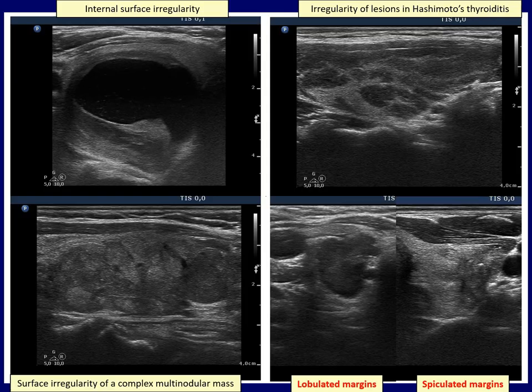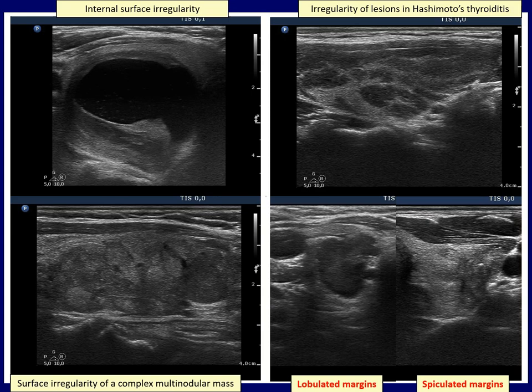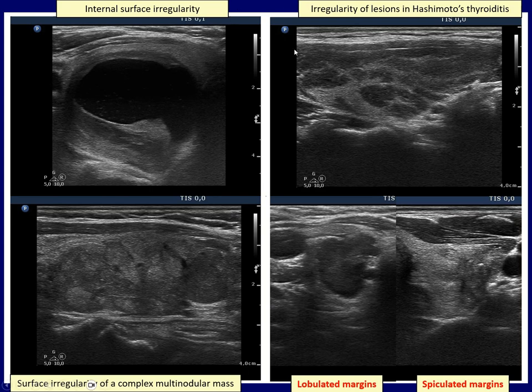In the left upper mixed predominantly cystic nodule, the borders between the cystic and solid parts are spiculated, but this is an internal irregularity which does not count. In the left lower case, multiple nodules form a large nodular mass composed of discrete lesions. The mass as a whole has an uneven surface, but single nodules do not. A typical case of focal Hashimoto's thyroiditis is demonstrated: the spiculations and lobulations of these areas do not count because these lesions are not pathological nodules.